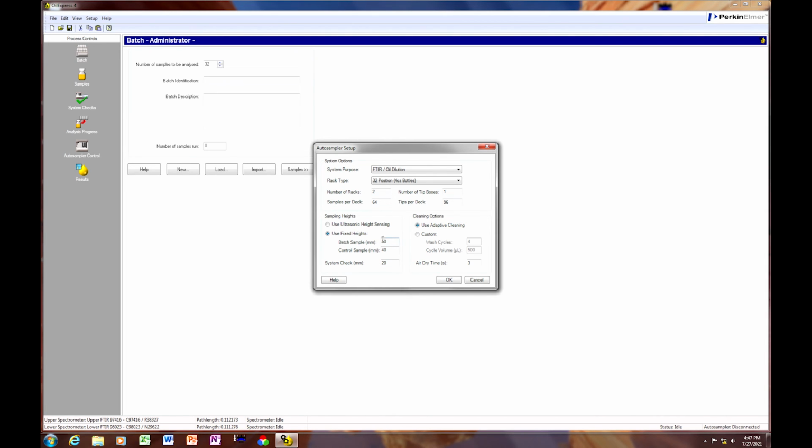So once you've done that and you want to return it back to its normal ultrasonic height sensing, you can just click back on the ultrasonic height sensing option or radio button and click OK.